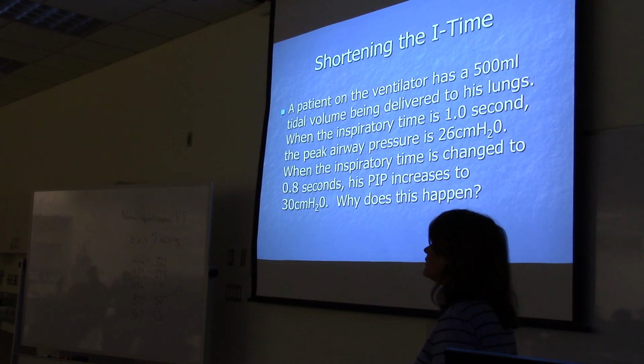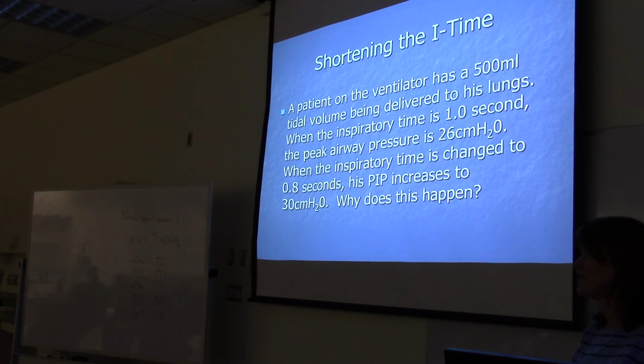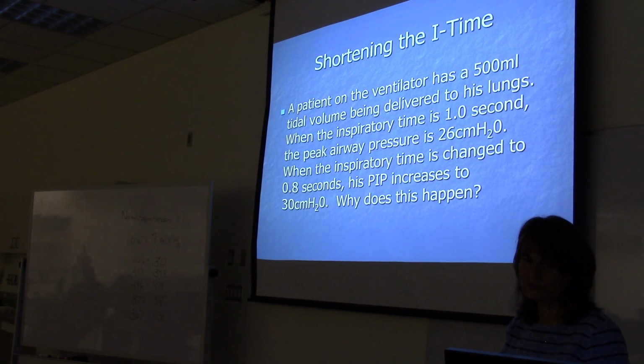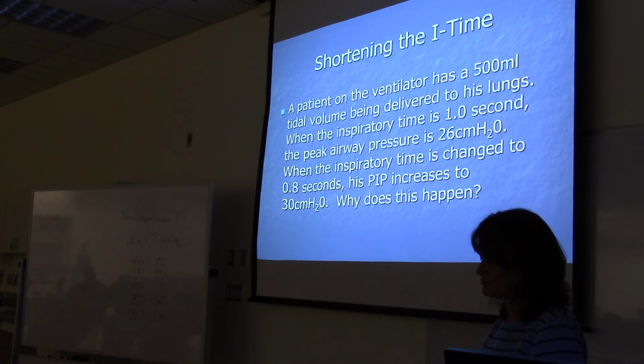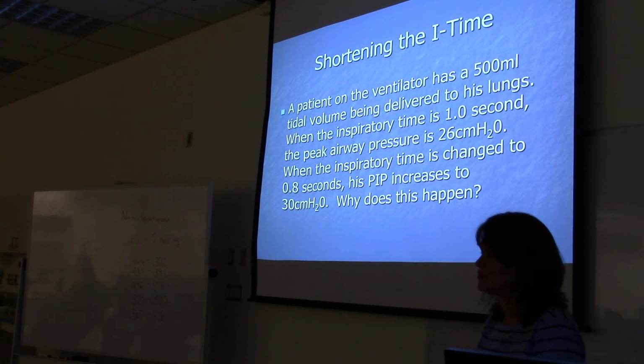Pressure to go that fast. Yes. You need more pressure to push the air in faster. Or should we say more pressure builds up when you push the air in faster?